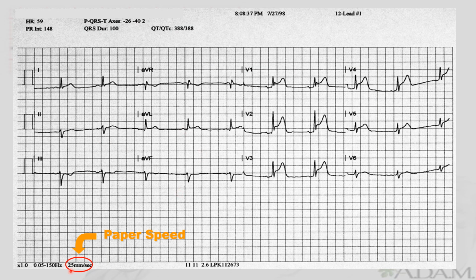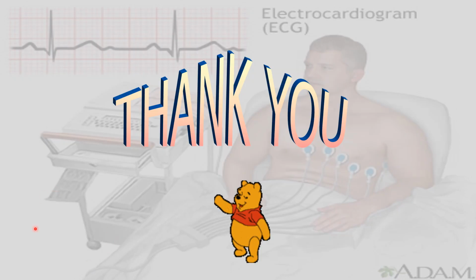Okay, so again, you check the paper speed, you check the calibration, and then calculate the heart rate, as we said, by either one of these two methods. Thank you.